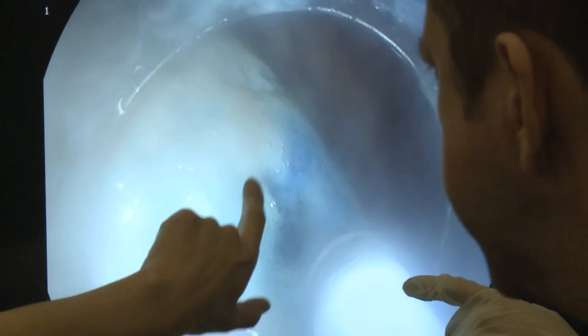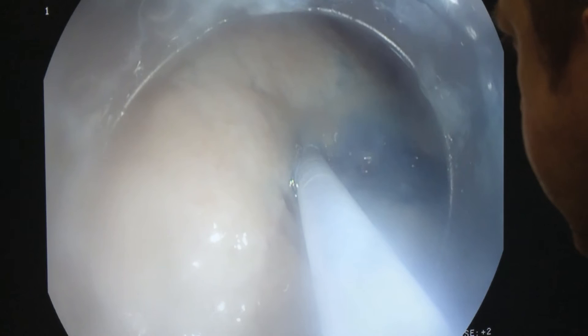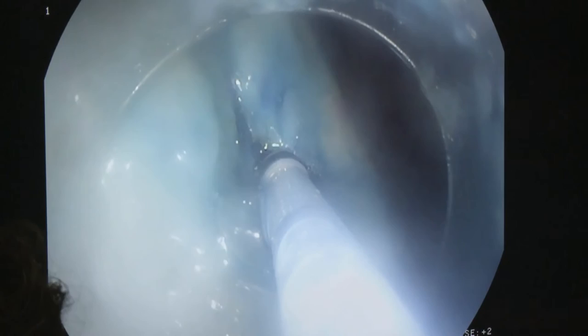In the same place? Yes, in the same place and rotate. Maybe rotate clockwise. Yes. And cut. And this side. Okay, that's good. Stop. A little bit tense. Okay, that's good. And cut more.